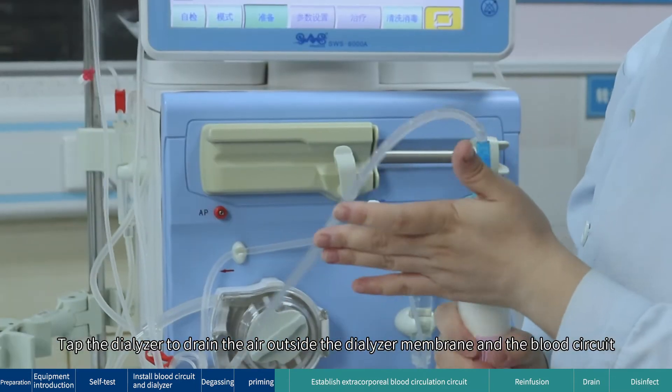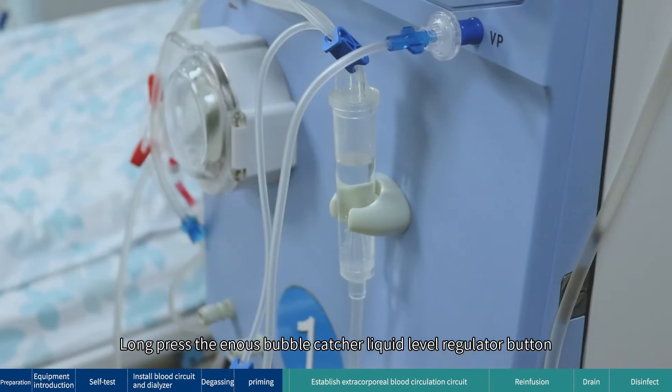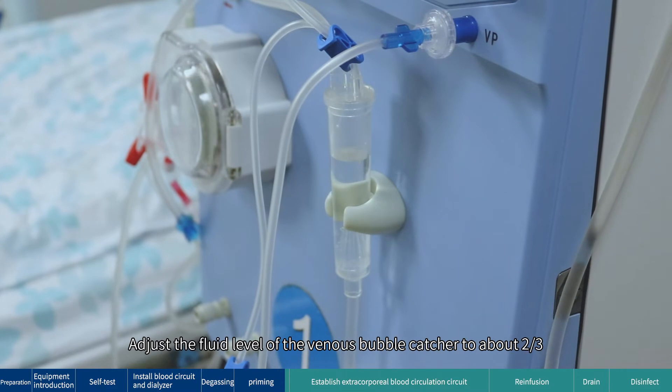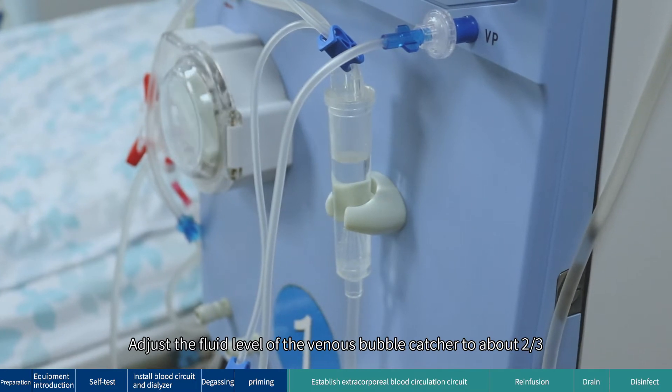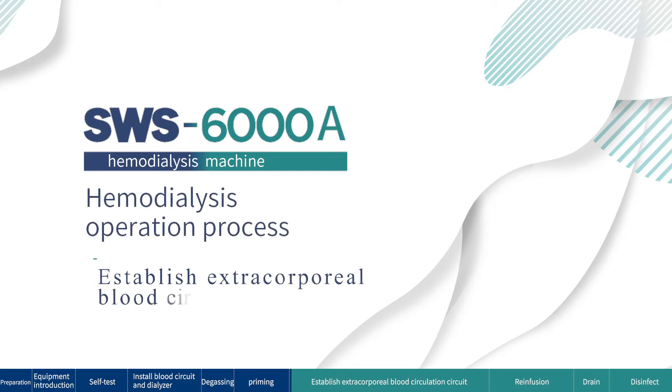Tap the dialyzer to drain the air outside the dialyzer membrane and from the blood circuit. Long-press the venous bubble catcher liquid level adjustment button to adjust the fluid level of the venous bubble catcher to about two-thirds. Establish the extracorporeal blood circulation circuit.